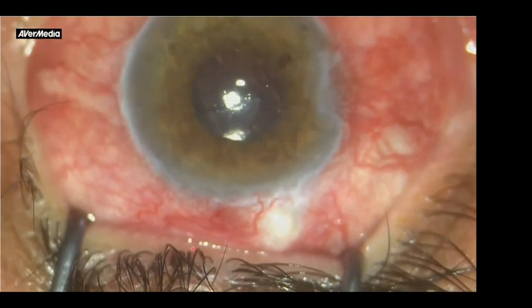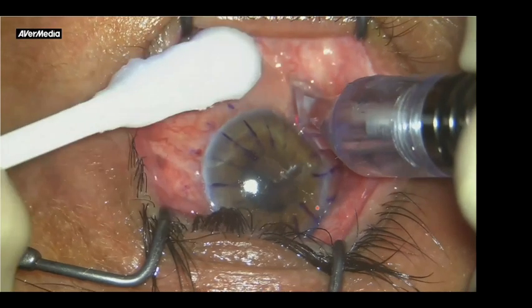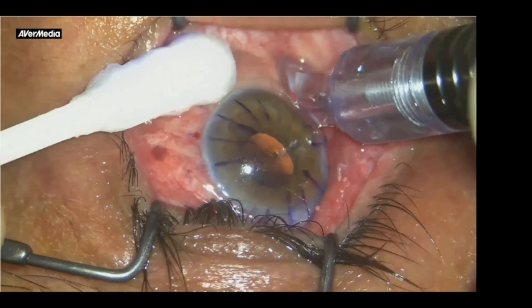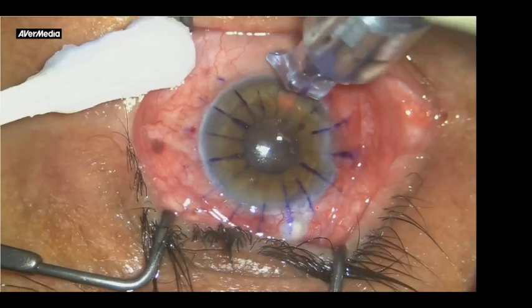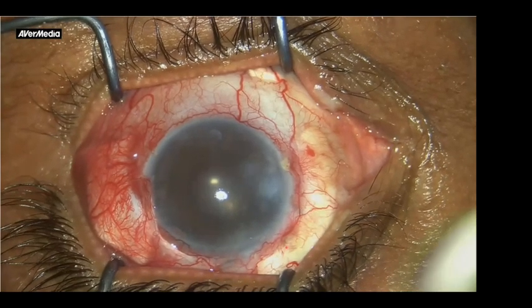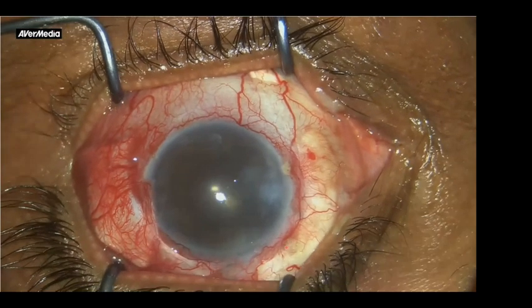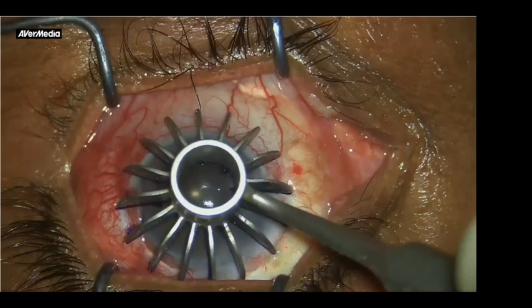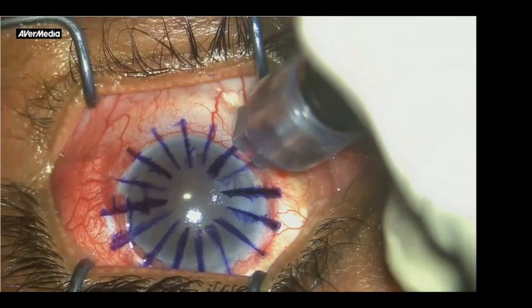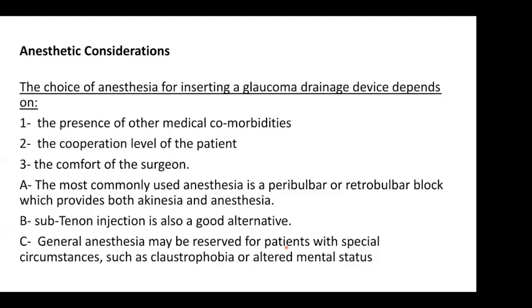Now in the OR, when you see a patient with this picture, with so much adherent conjunctiva, there is no way to go for a valve, whatever dissection you do, so I just take a shortcut and go for diode. Again here, there is no conjunctiva. This is so obvious, but some patients, you will discover this on the operating table, so it's better to know in advance. If the conjunctiva is very adherent, I'll go to my beloved cycloablative procedures. There is no way to dissect a conjunctiva that is very adherent to the sclera.